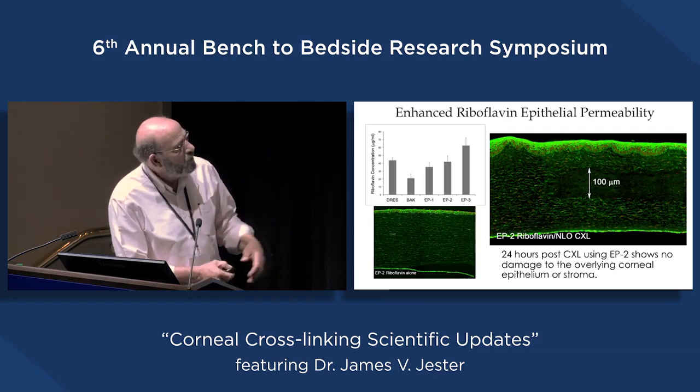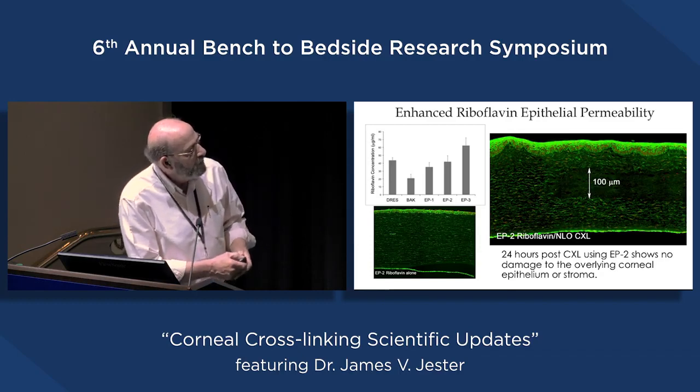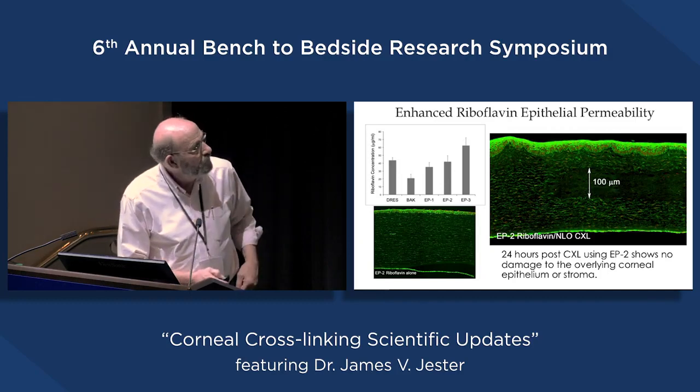This was 24 hours after nonlinear optical cross-linking. This 100 microns are where we cross-link. The overlying epithelium's normal, and the underlying endothelium and the keratocytes are all normal. So we think this has great opportunity for the future.